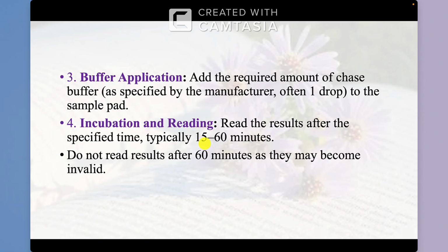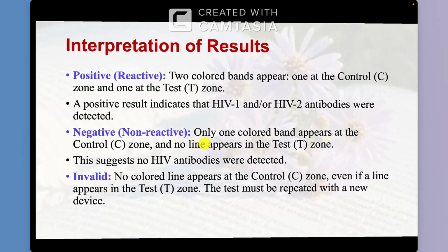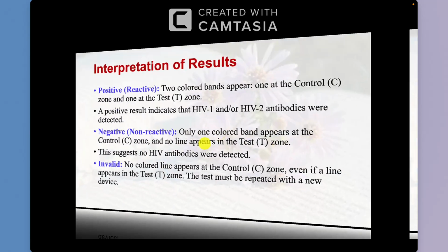As I said, it is a rapid test. Here we can detect HIV-1 and HIV-2, of course, the antibodies and antigens, and strains of the HIV. As I said, let me show you the positive.